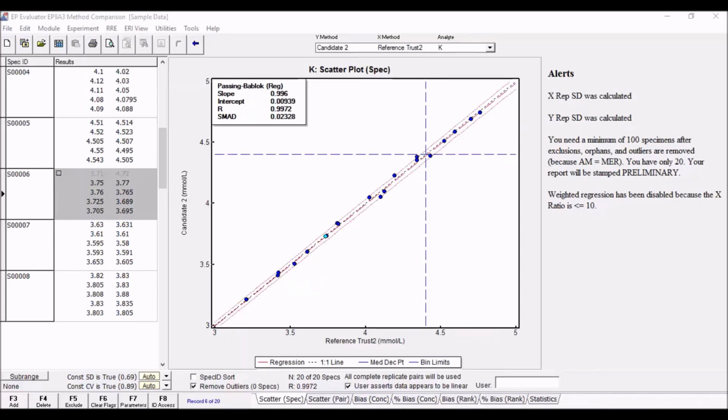So now we have a good data set, we can move on to the core of the module, which is the processing, analysis, display and statistics generation for the experiment. We can see on the right of the screen that EE has already given us some information and warning messages based on its automated preliminary data evaluation.